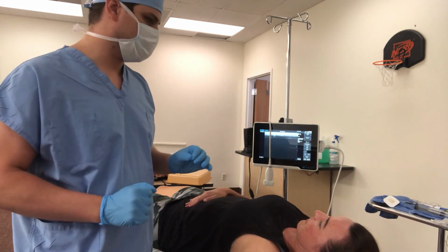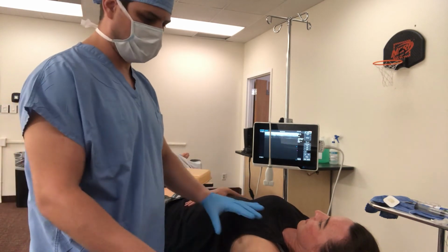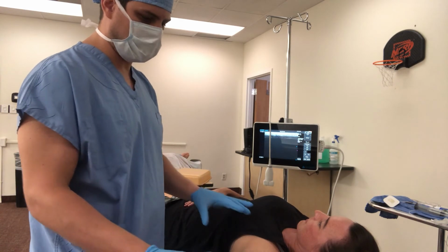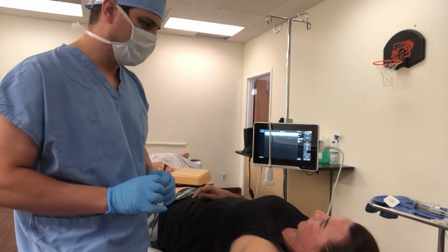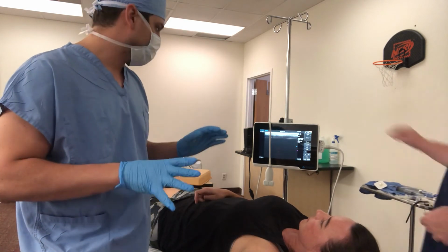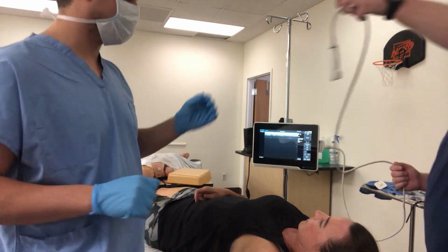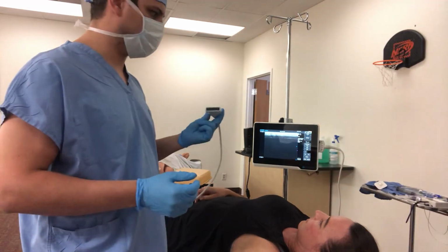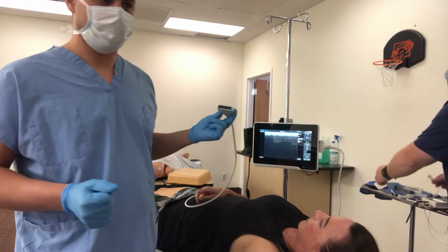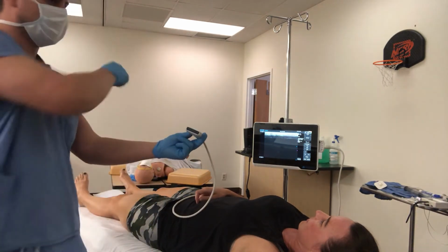I'm going to ask her to be supine with her arm in a 90-degree position so I can access the axilla. I am sterile. The patient's sterile. I'm going to ask Case to give me the ultrasound, and then sterilely place some gel on her axilla. The gel's right here.